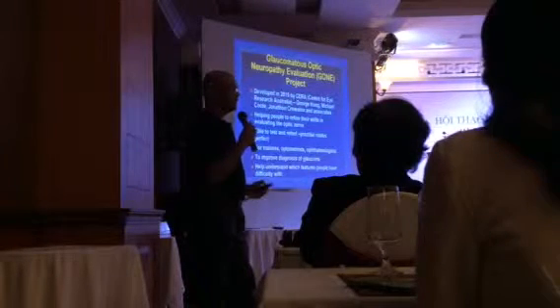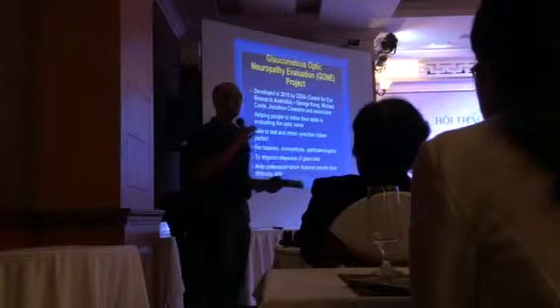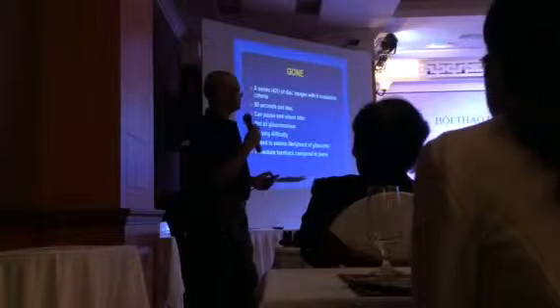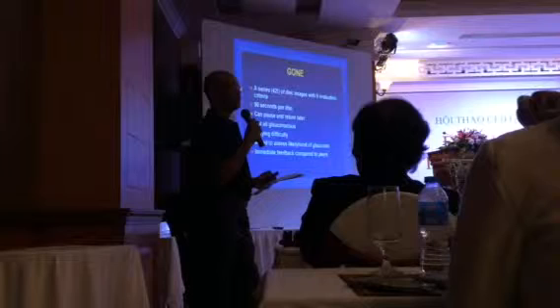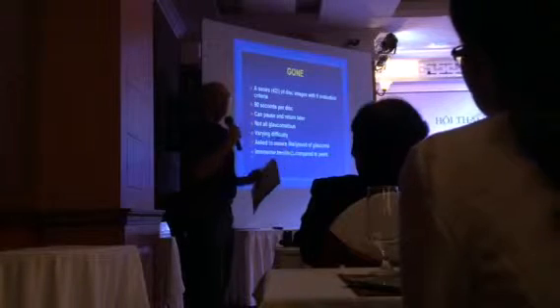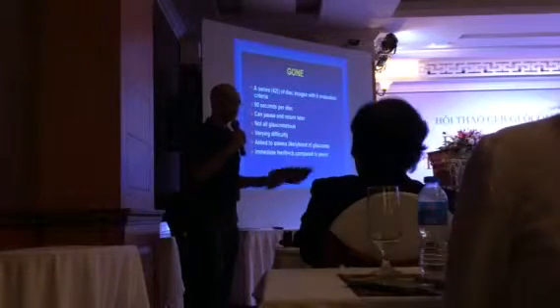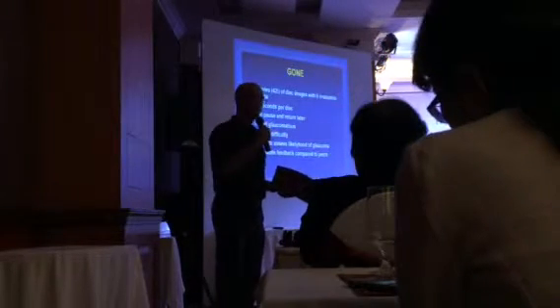And as we heard speaking last night, there are also racial differences between the shapes of optic discs. So with the GON project, you get a series of 42 disc images, and for each disc you have to evaluate 9 criteria, and for each criterion there's a drop-down menu of about 4 or 5 options. It can be very time-consuming.